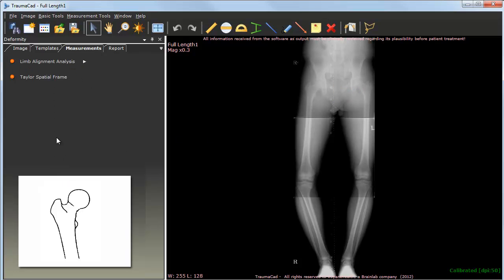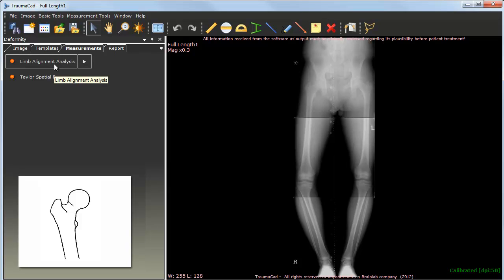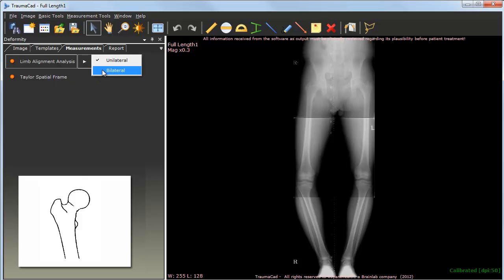On the measurements tab, a variety of measurement tools are available according to the currently selected procedure. In this case, I'd like to analyze the patient's limb alignment, look for skeletal deformities, and plan for their correction.